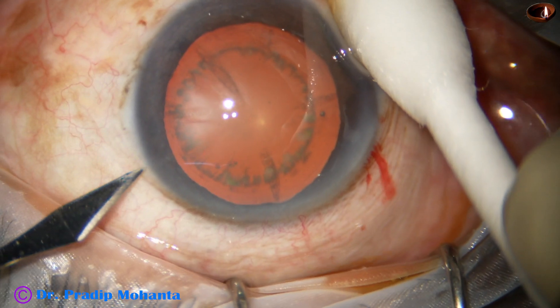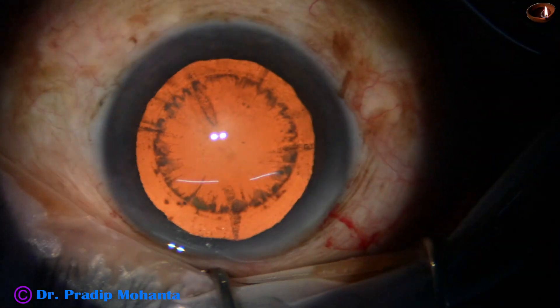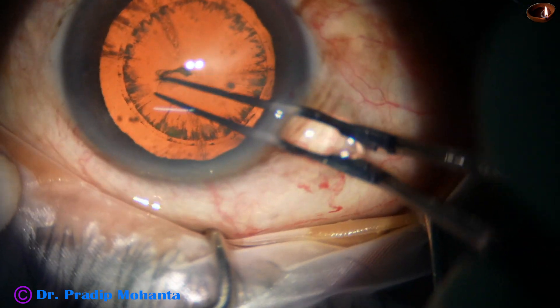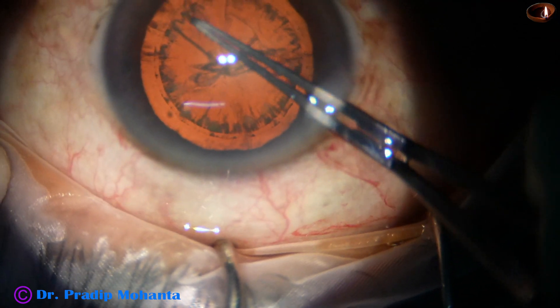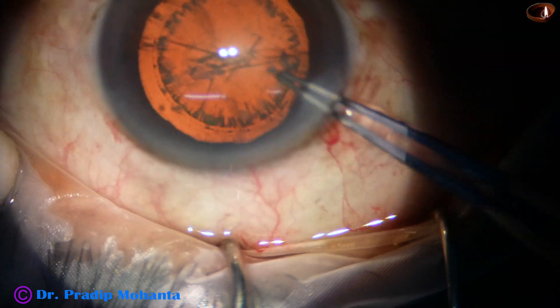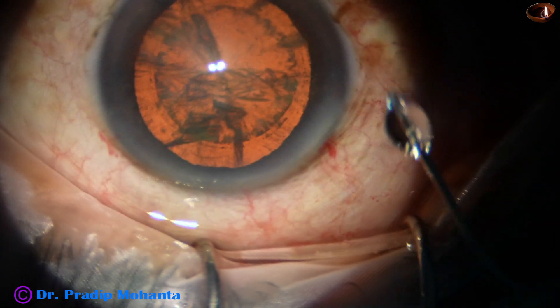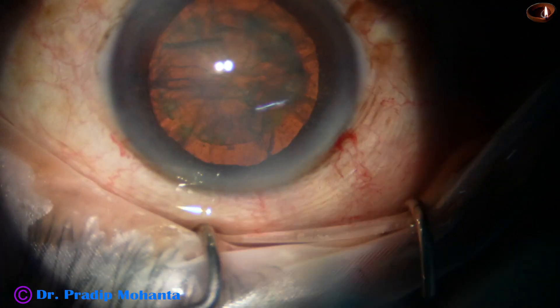Let us observe the whole surgery. By this time, the main incision and a side port has been made. This is stereo coaxial illumination of the Lumera T microscope. Capsulorexis is being done with the help of utrata forceps. Hydrodissection is done with a 27 gauge cannula using BSS or Ringer's lactate. The nucleus is mobilized.